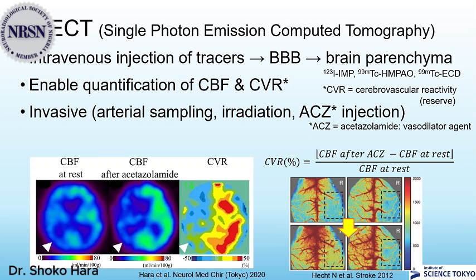Although the normal distribution of each tracer differs slightly from that of 15O, SPECT-derived CBF values correlate well with PET-measured CBF.